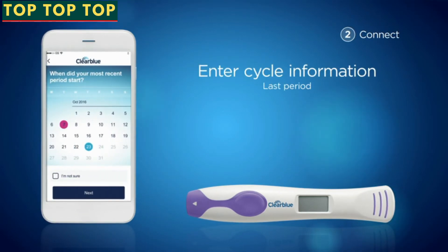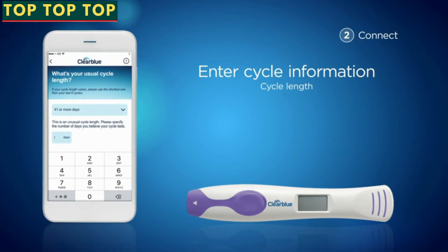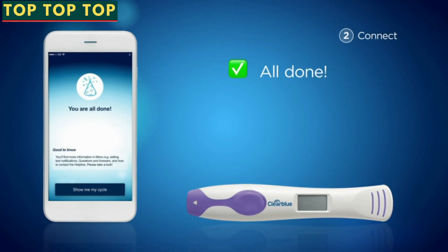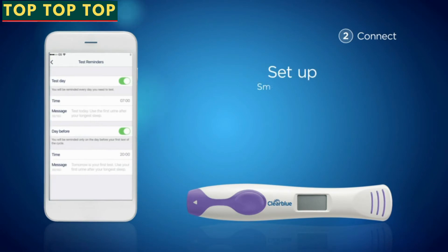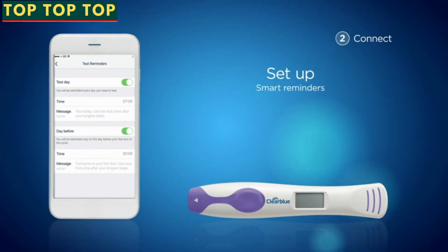Just enter a few more details, including the date of your last period and your usual cycle length. All done — setup is complete. If you wish to, you can allow notifications on your phone and switch on Clearblue Connected Smart Reminders, so that the app can alert you on the right day to take the test.